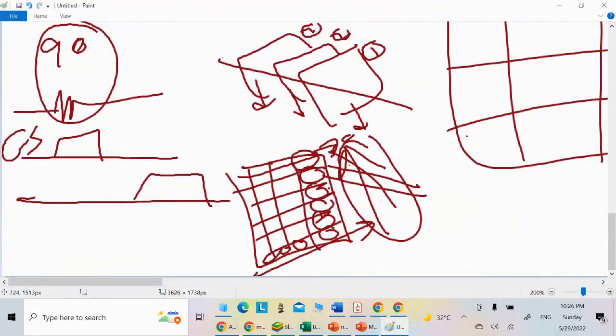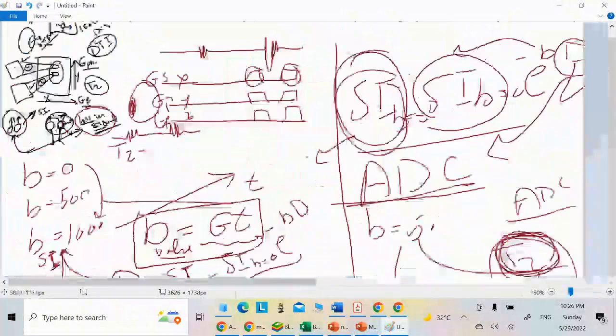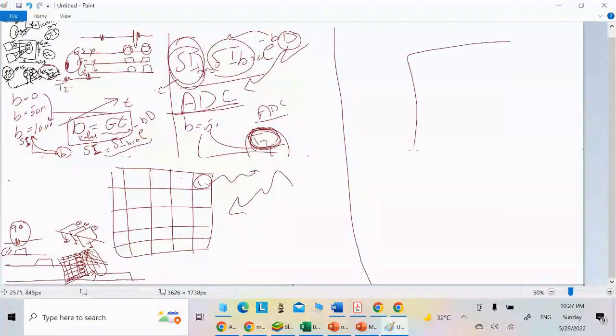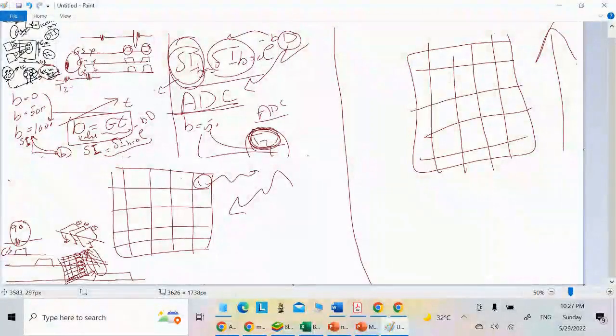So you have worked on the y-axis, distinguishing between here and here and here. Then, when you come to record your signal, you need to apply the frequency encoding gradient to differentiate between the voxels on the x-axis. The gradient is not only applied to this column, it encompasses all slices from left to right or from right to left, which is the frequency encoding gradient.